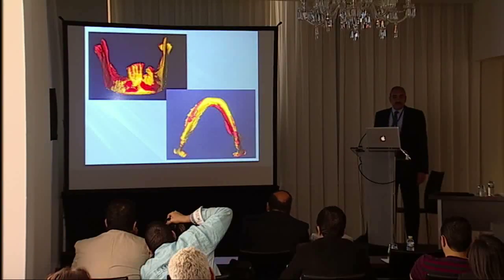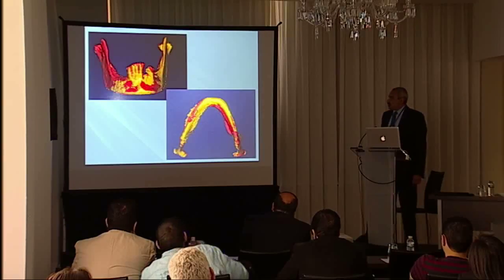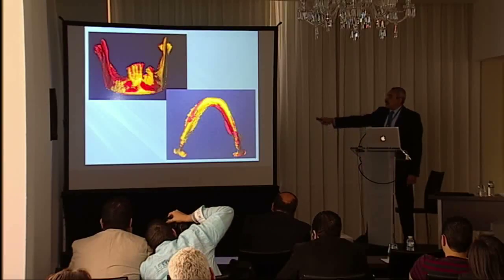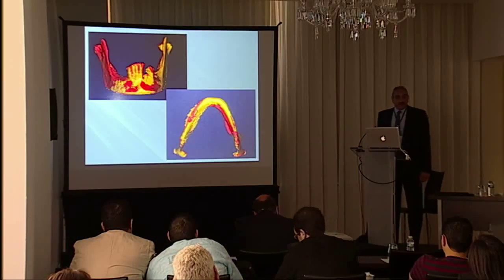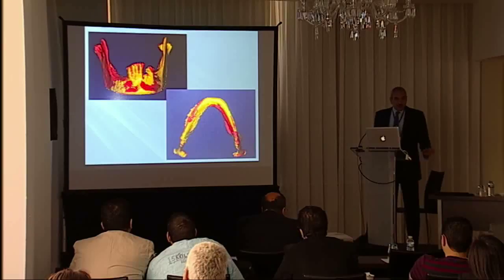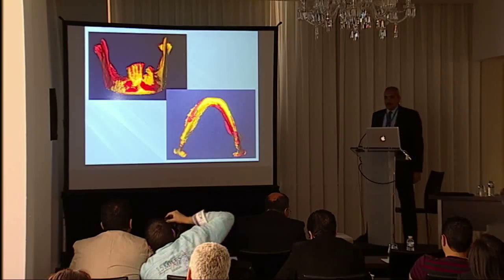And this is the pre and post-operative CT scan superimposed on each other. The yellow is the pre and the red is the post-operative, and we can see they almost match identically, so we know that those splints guided the surgery the way we planned it preoperatively.